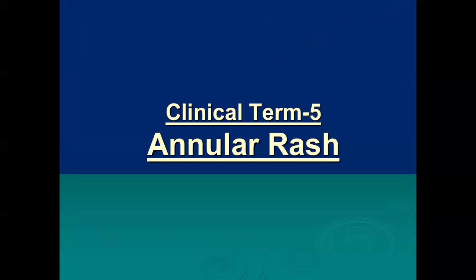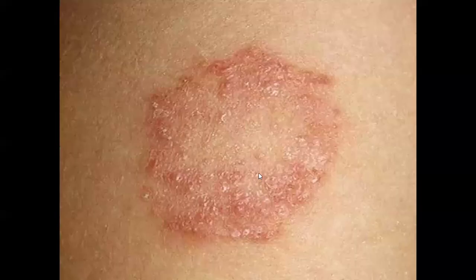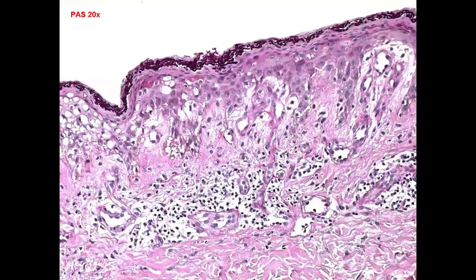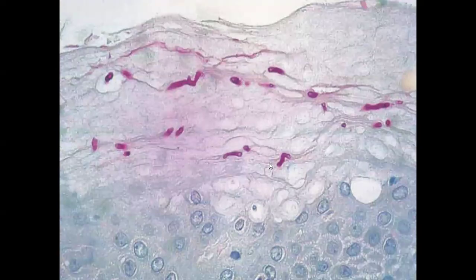The next term I'm going to discuss is an annular rash. The annular rash, which is characterized by ring-shaped lesions, is seen in a few clinical conditions. The first one is here. It is an annular rash with quite a bit of itching, and this is commonly known as ringworm. And on histopathology, we do a PAS stain, and you can find numerous septate hyphae in the stratum corneum. These are the septate hyphae seen in the stratum corneum on PAS stain.